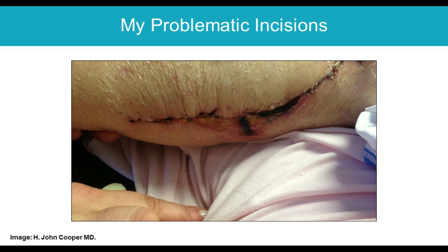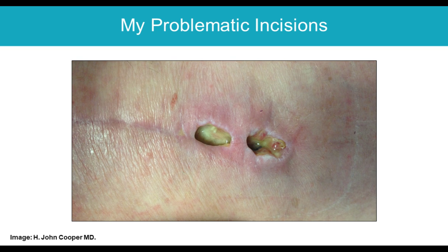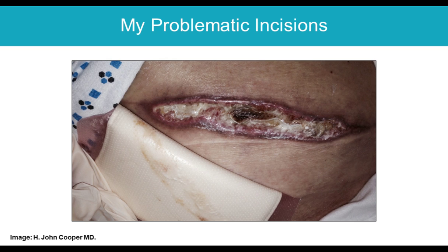He was referred into our institution. When he went to surgery for an explant and spacer, surgery was uneventful, but you can see how much wound necrosis he has at the edge of his incision in this fairly high-risk patient. This is another delayed wound healing in a patient with diabetes following knee replacement.